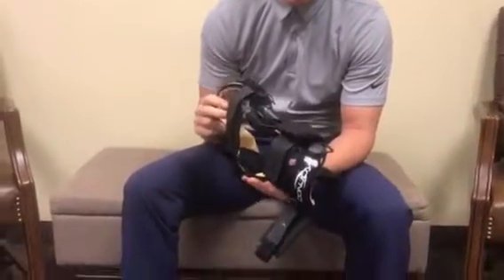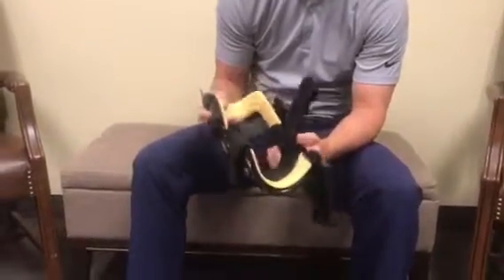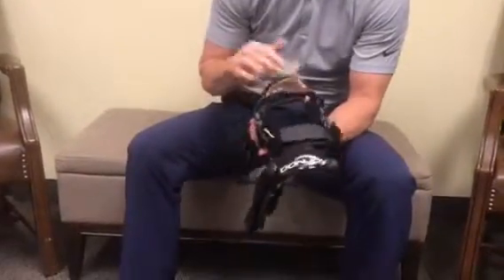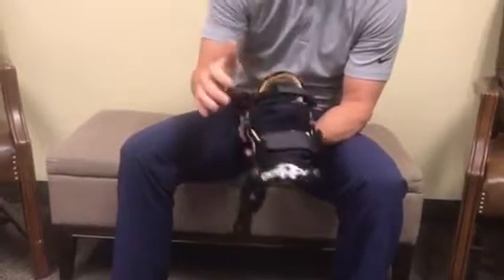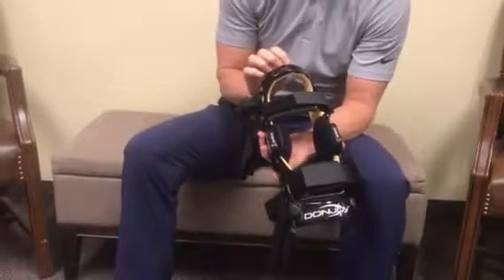We have our DonJoy custom elbow brace and I'll teach how to fit it today. You have your posterior side here — this is the forearm side with the DonJoy insignia — and then your tricep side.